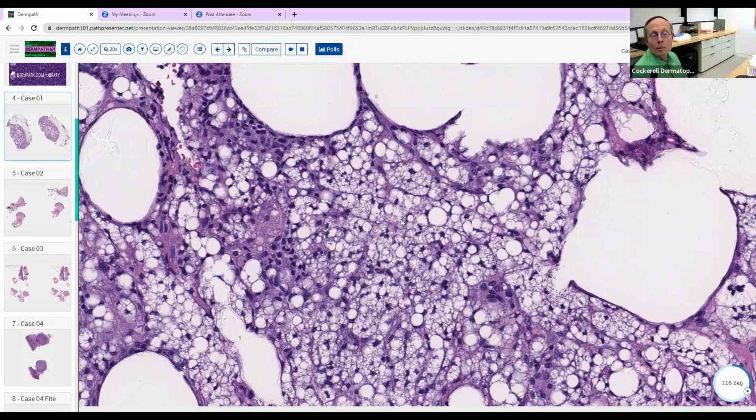What if it's a little baby and they come in with panniculitis, like the neonatal kind? You could see that, but also think of a hibernoma as well. Oh, brown fat cells, right. The brown fat. And those can give you this little bubbly morphology too. So that's the mulberry-like cells. So that's just something to think about in the differential diagnosis.